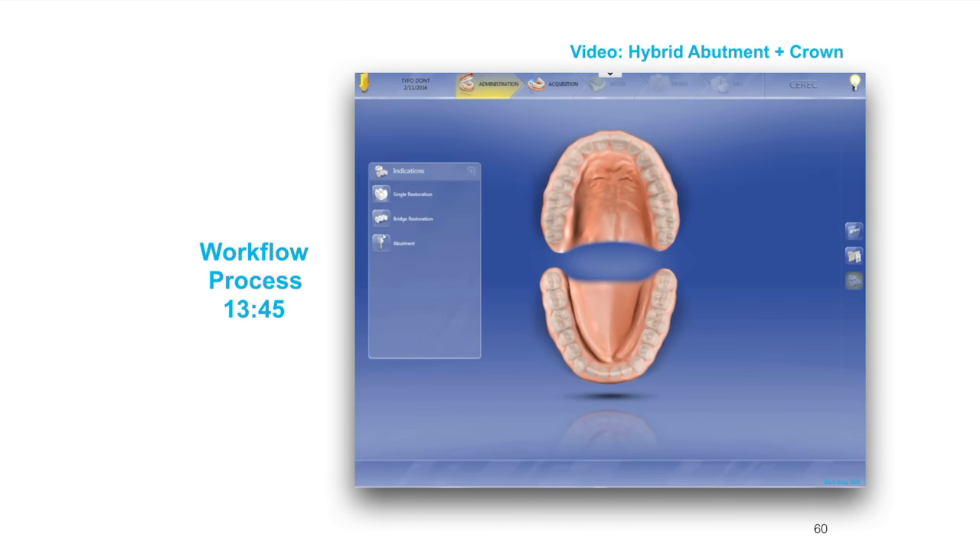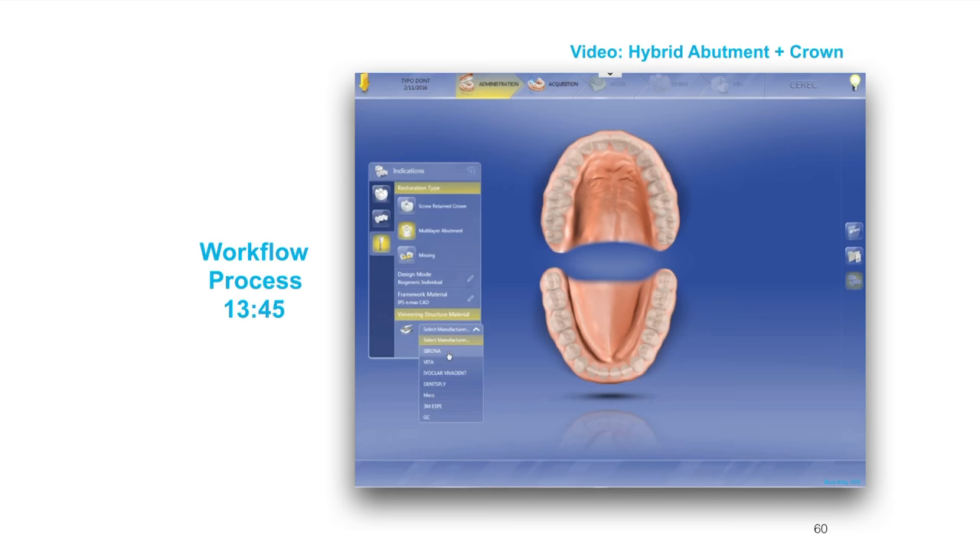The workflow for this design is 13 minutes. You'll notice I'm selecting multi-layer abutment, then we're going to select biogeneric individual. The material is Emacs CAD, which I'm using for both the framework and the veneering structure. Once I select those materials, I'm going to tell it I'm using a tie base and it's going to have me select who makes the tie base — that's Sirona — and then you've got to specifically select the type of tie base that you're using.